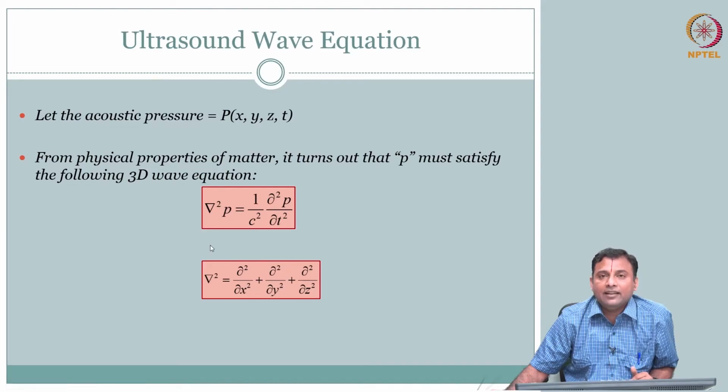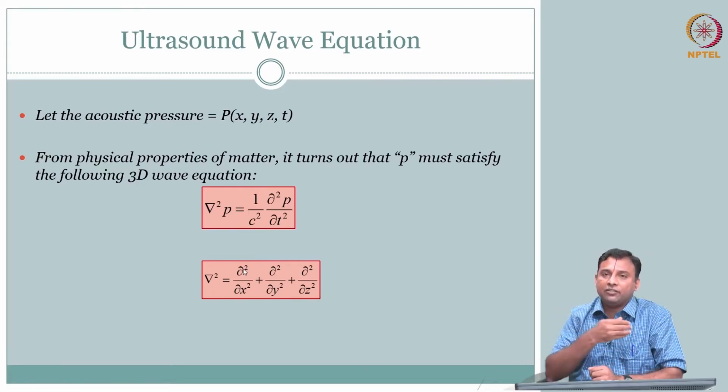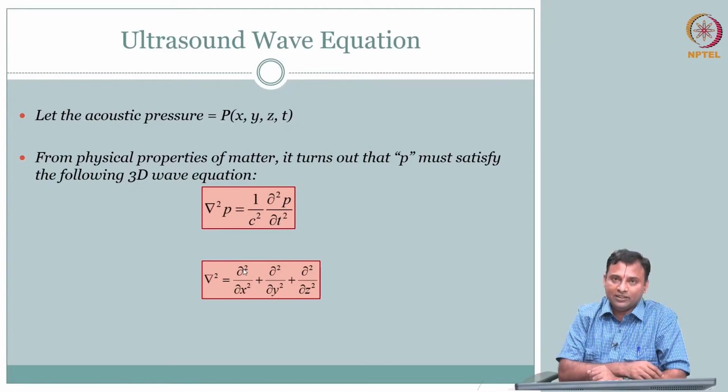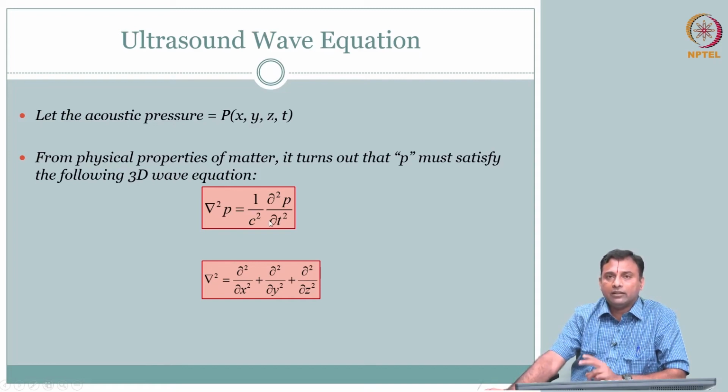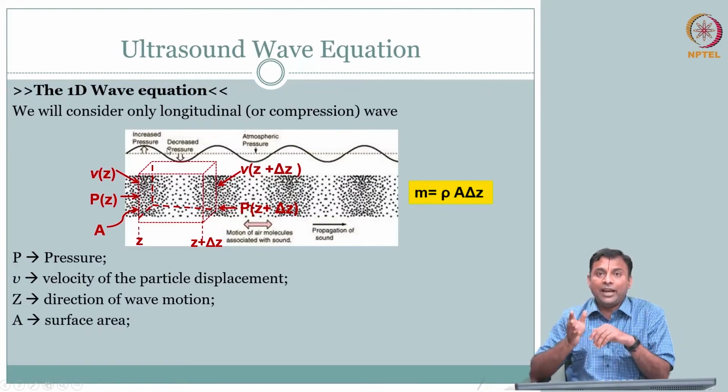However, like we said, this is fine, this is all powerful, neat, but we are interested in making life easy in the context of the application, which is biomedical imaging. So in our case, even though 3D is there, we will look at at least 2 different types of waves that are applicable for imaging. One is your plane waves. What is a plane wave?